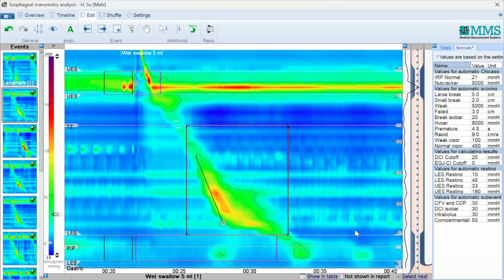Usually the total swallowing time is like 5 to 6 to 8 seconds. I mean, this is the progression from here to here. It sometimes takes like 5 to 6 swallows. But to start the next swallow, we have to wait 30 seconds. We have to wait 30 seconds to give the patient the next sip of water.